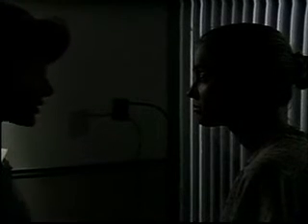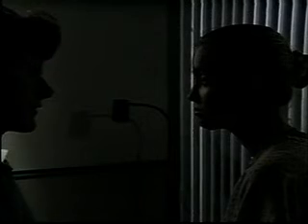After darkening the room, ask the patient to look over your left shoulder at a specific spot on the wall. I want you to look over my left shoulder. Using your left eye and left hand, examine the patient's left eye.